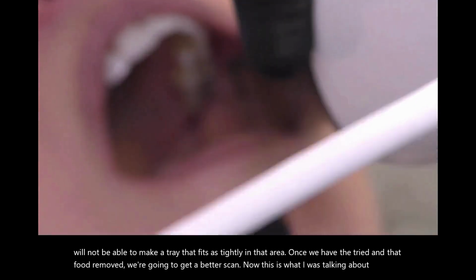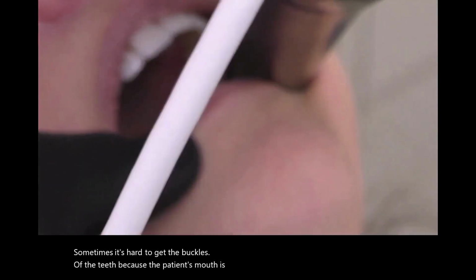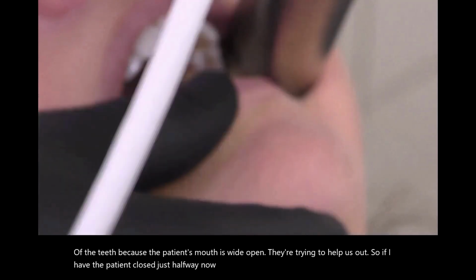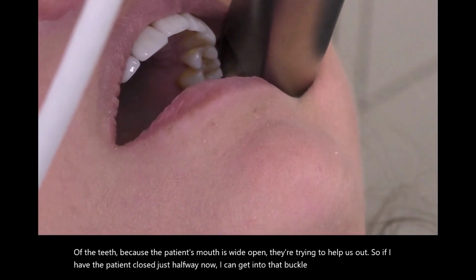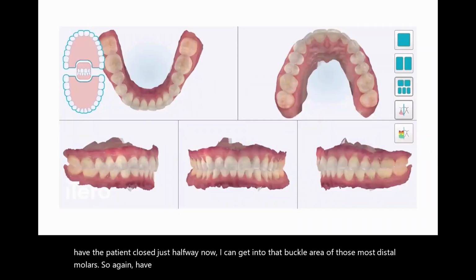Sometimes it's hard to get the buccals of the teeth because the patient's mouth is wide open. They're trying to help us out. So if I have the patient close just halfway, now I can get into that buccal area of those most distal molars. So again, have the patient just close down halfway.